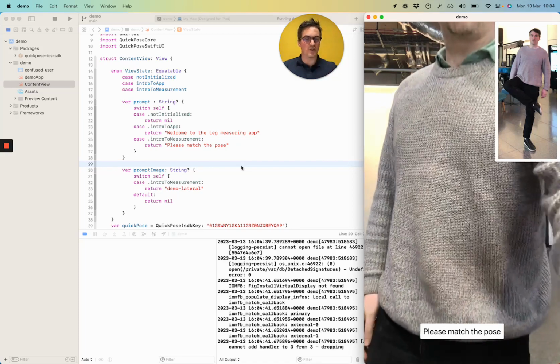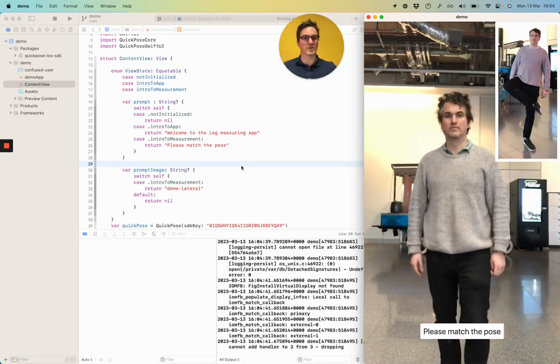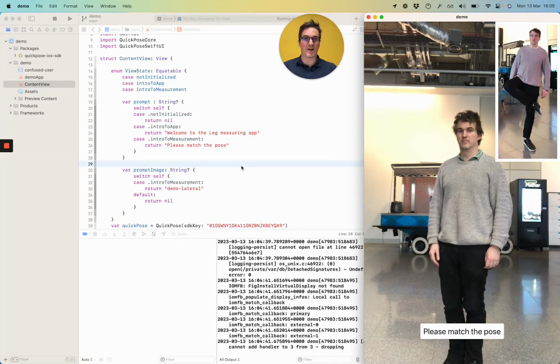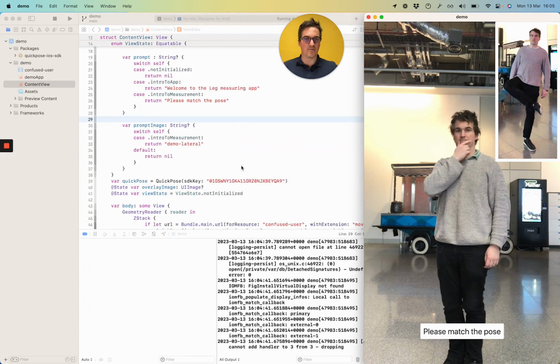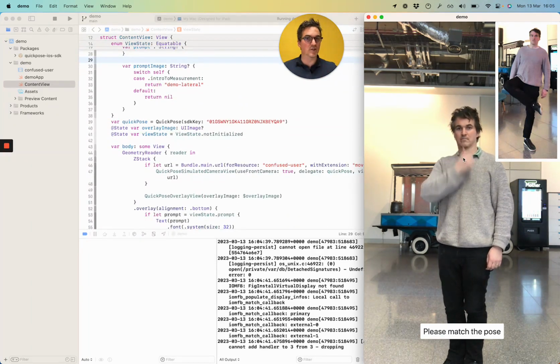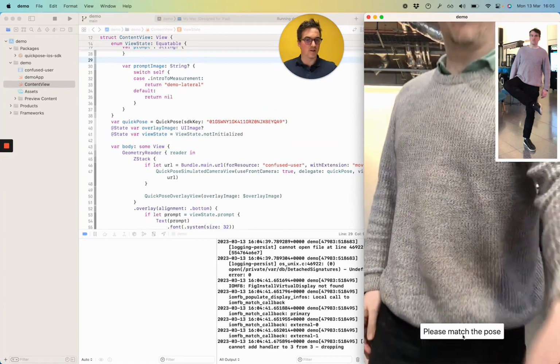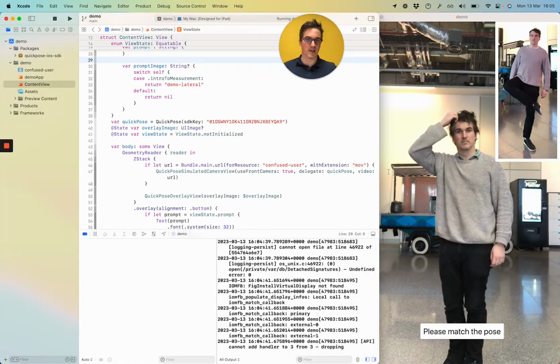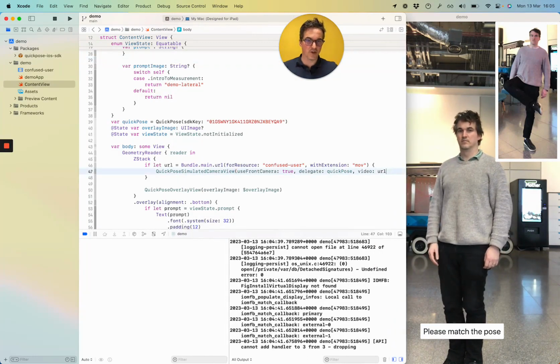There's two more things I want to do first, though, because when you start adding a more complex video, your demands of the app radically improve. At the moment, the app is smarter than the video. What we can see here is the video is looping, but it's getting stuck in the end state. For development purposes, it's quite helpful to reset the state. So there's an extra little feature here.